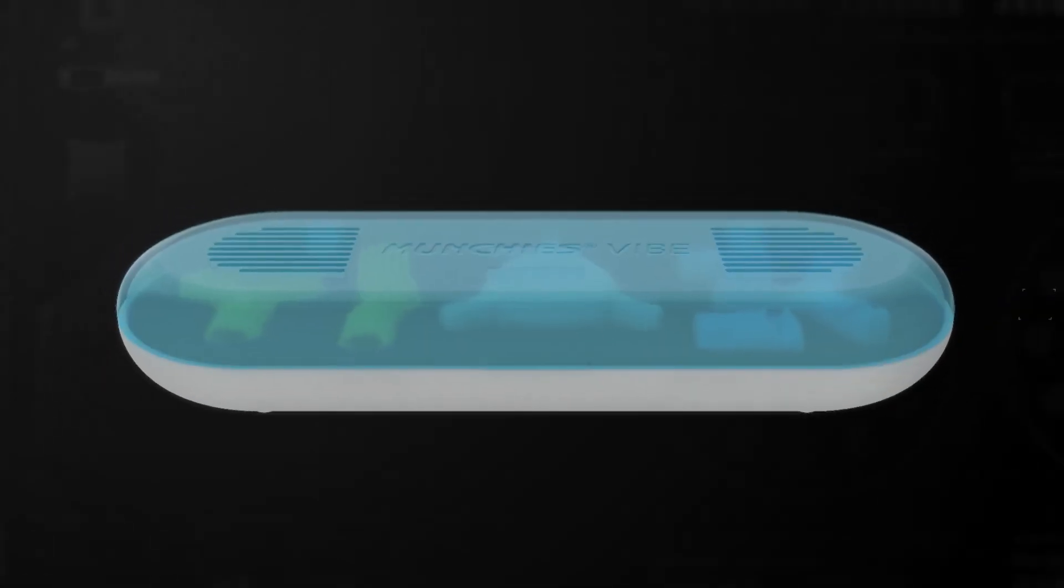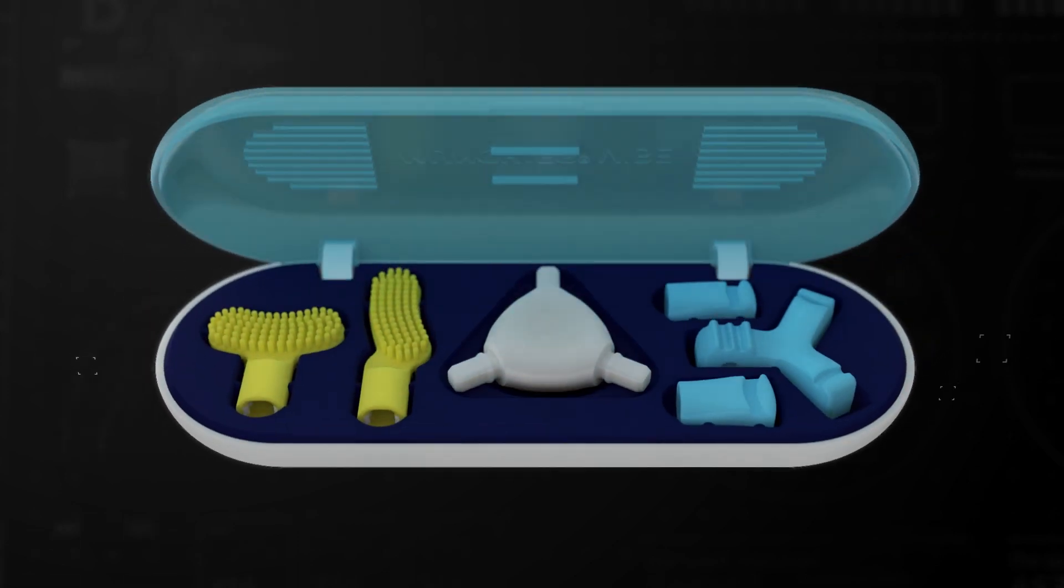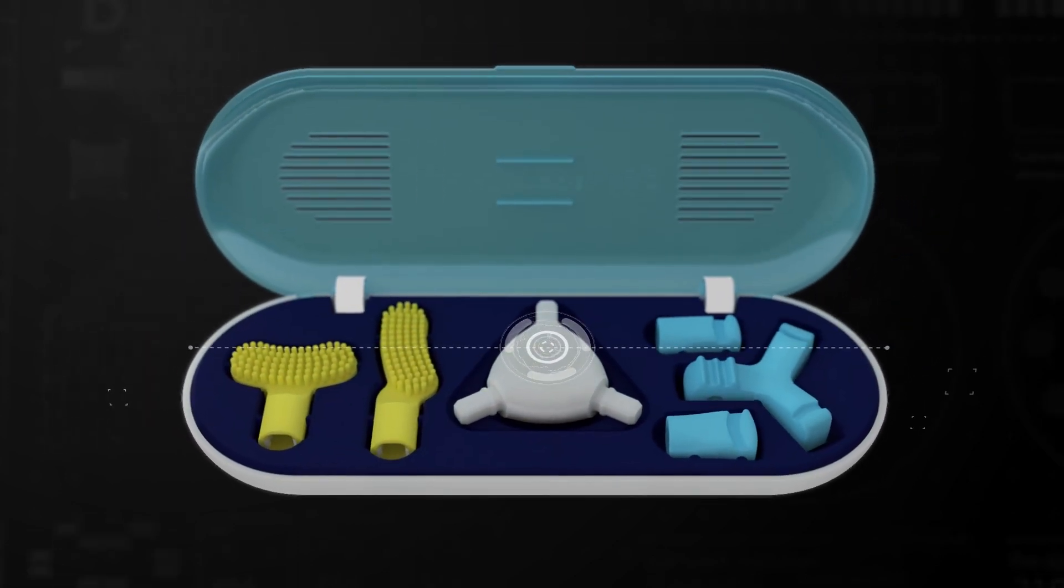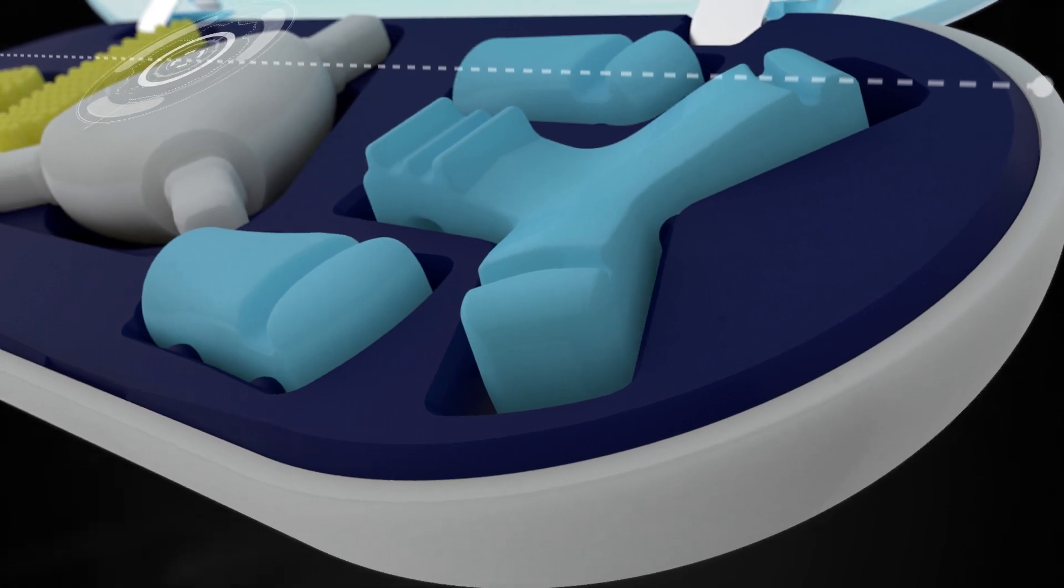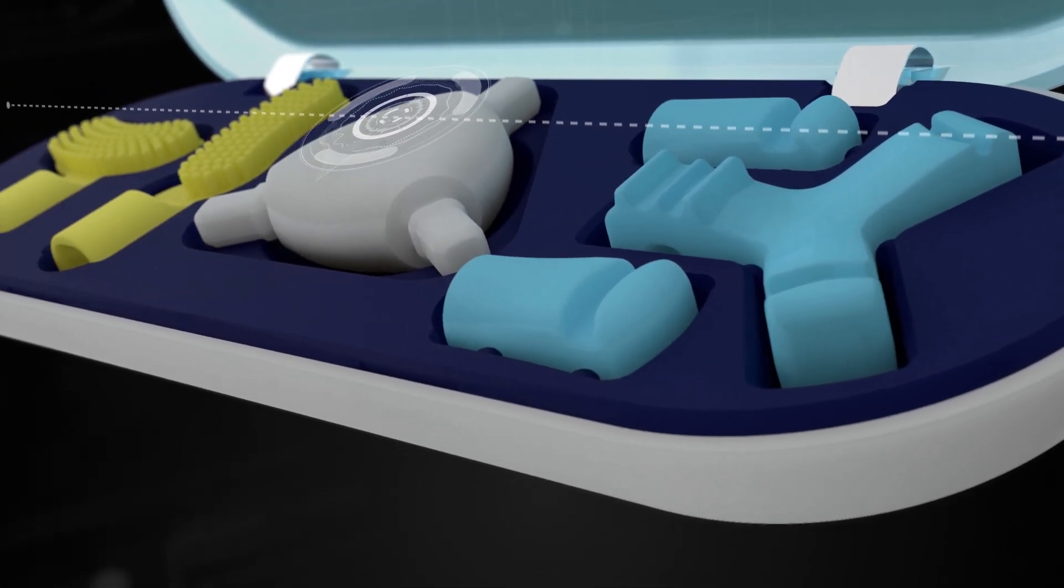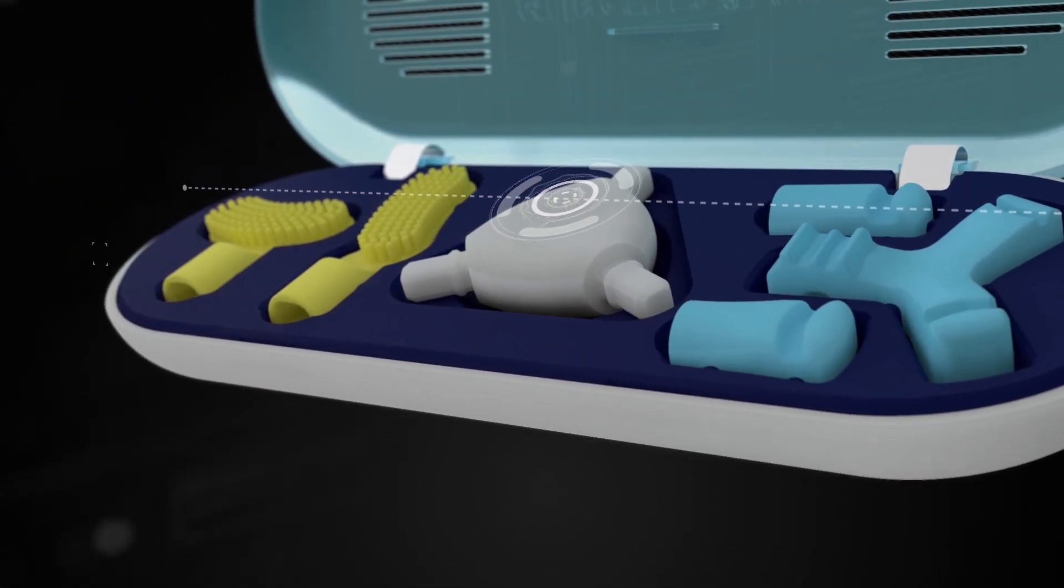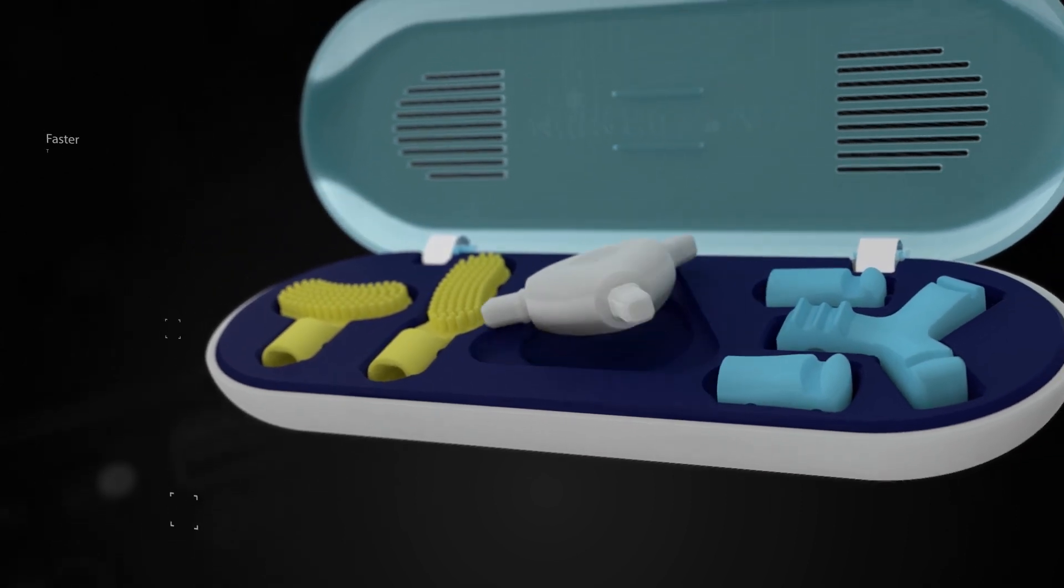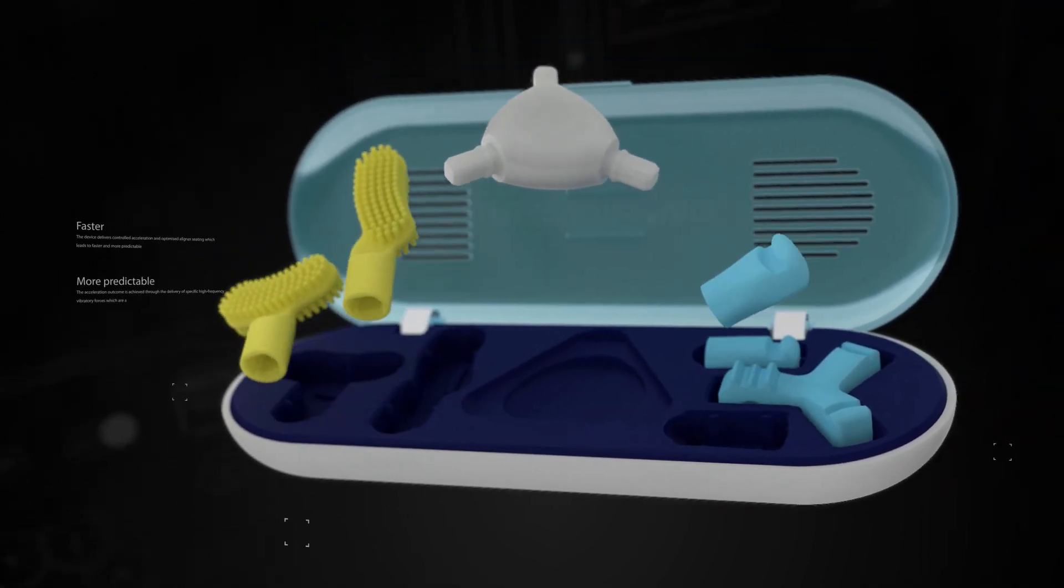Munchies Vibe has been created to rewrite the future of predictability in clear aligner therapy treatments. The device delivers controlled acceleration and optimized aligner seating which leads to faster and more predictable orthodontic movements.